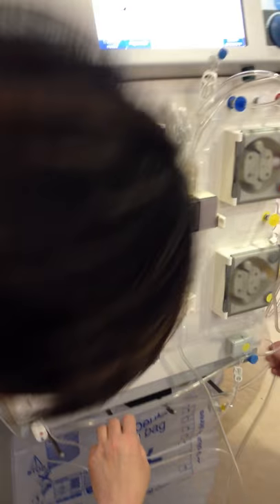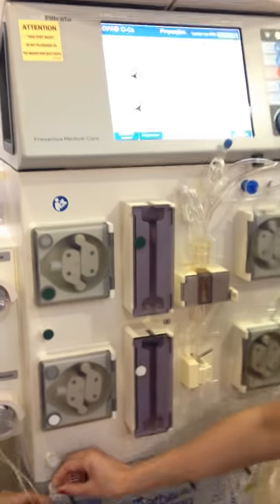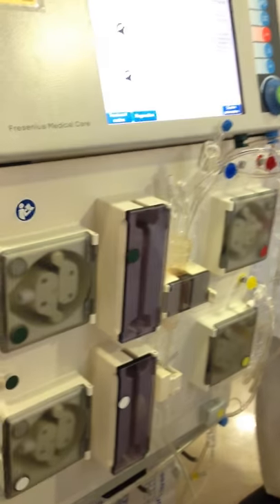Are all the patients okay there? So now the CRRT setup will take how long? 1.5 hours? 2 hours? 3 hours? No. This is only 30 minutes. Because for us, we are new, 45 minutes for you, 1 hour. In my record it's already 23 minutes, not yet primed. It depends on the age.